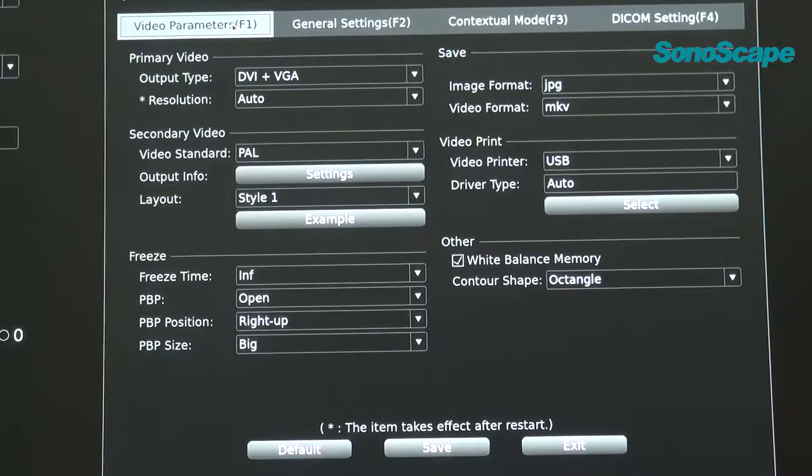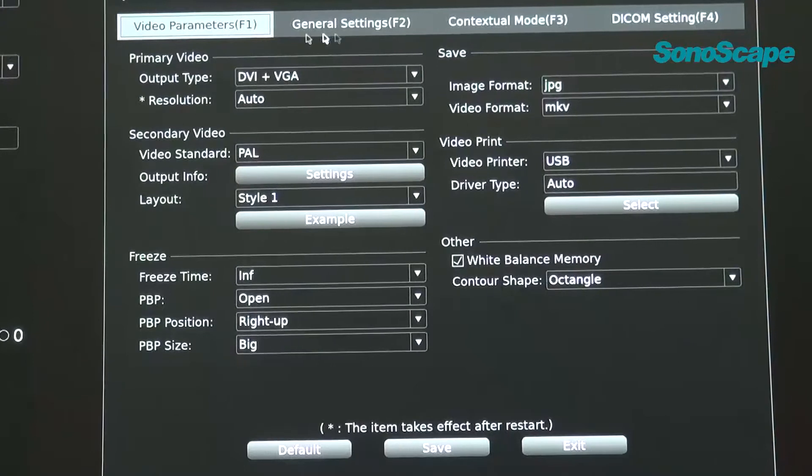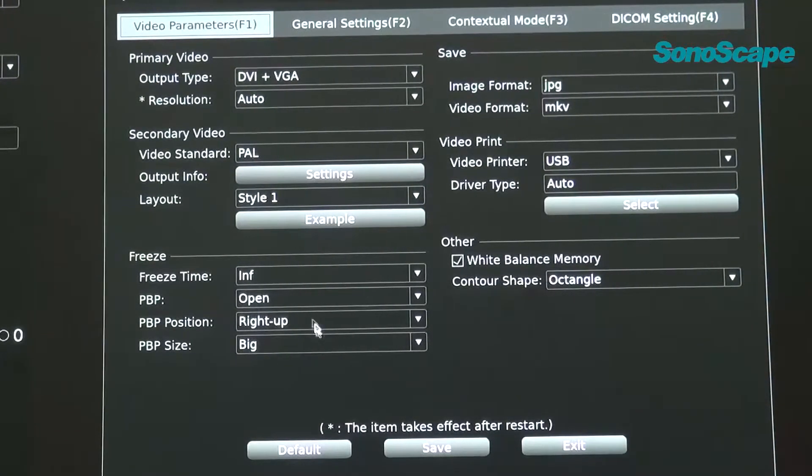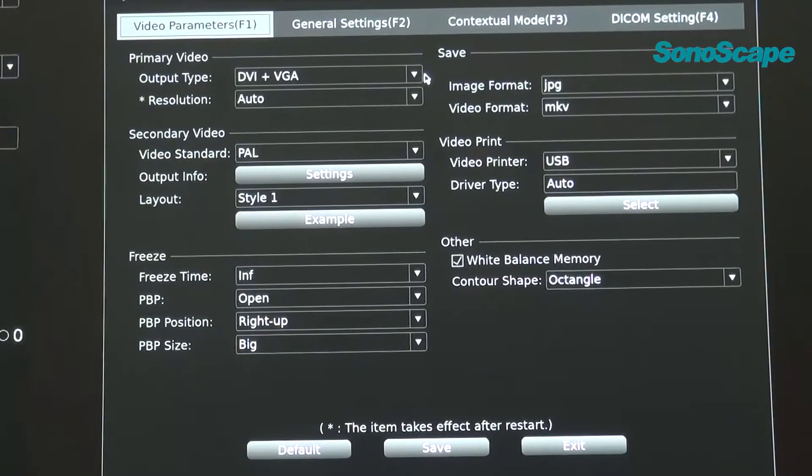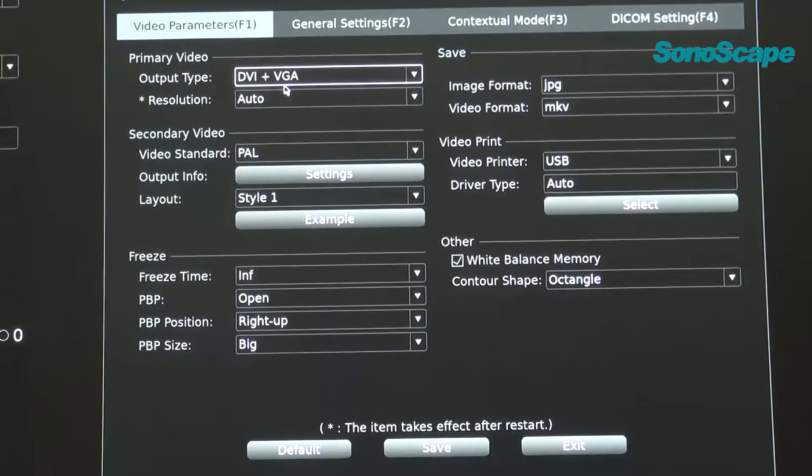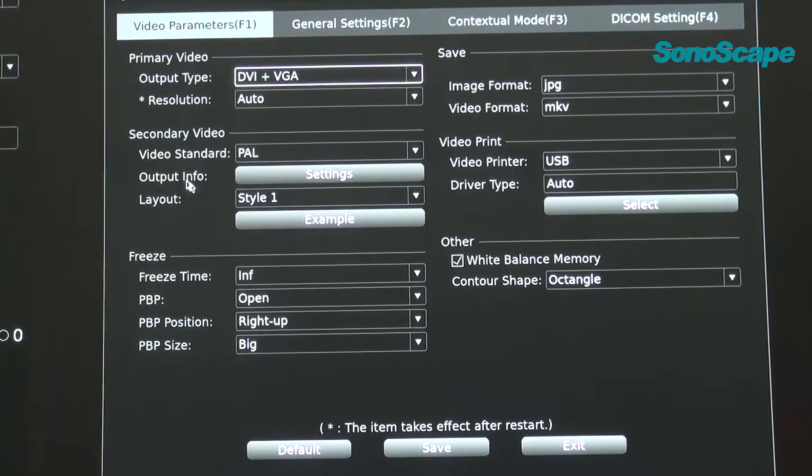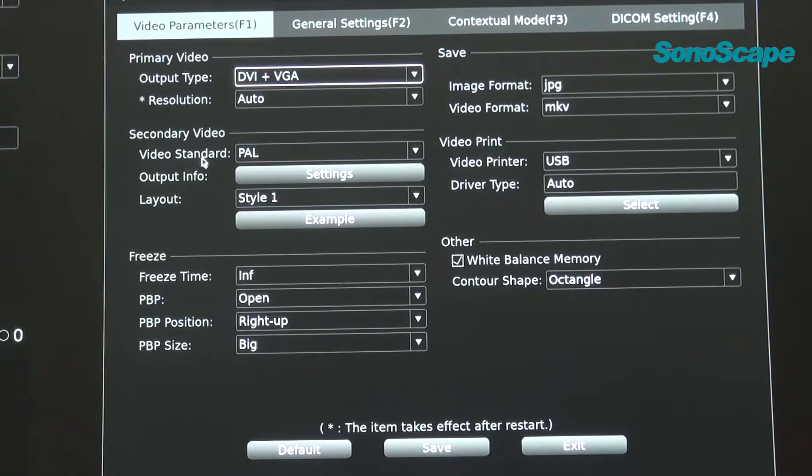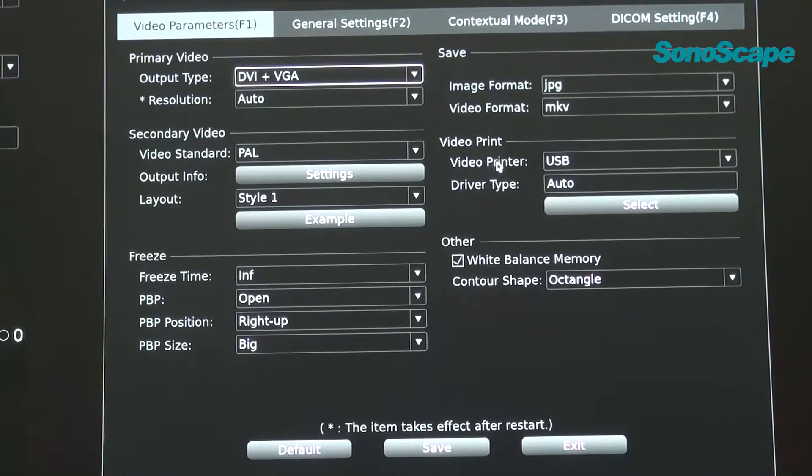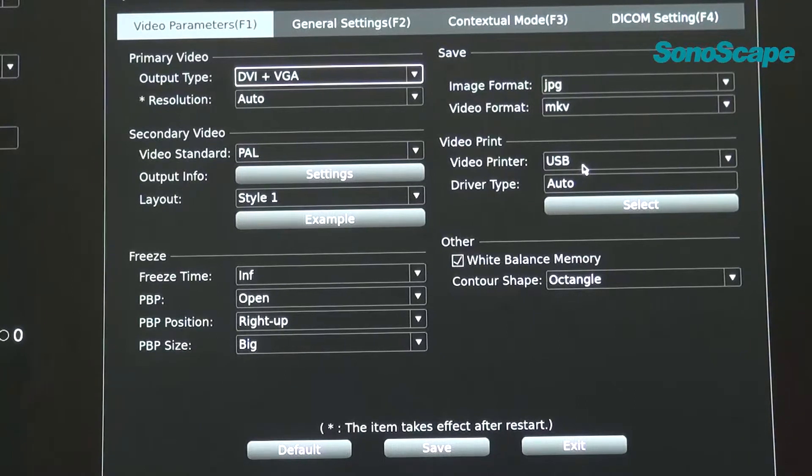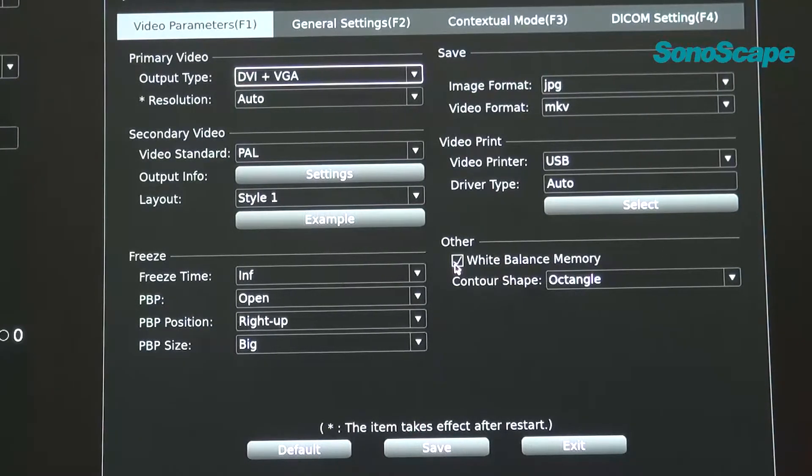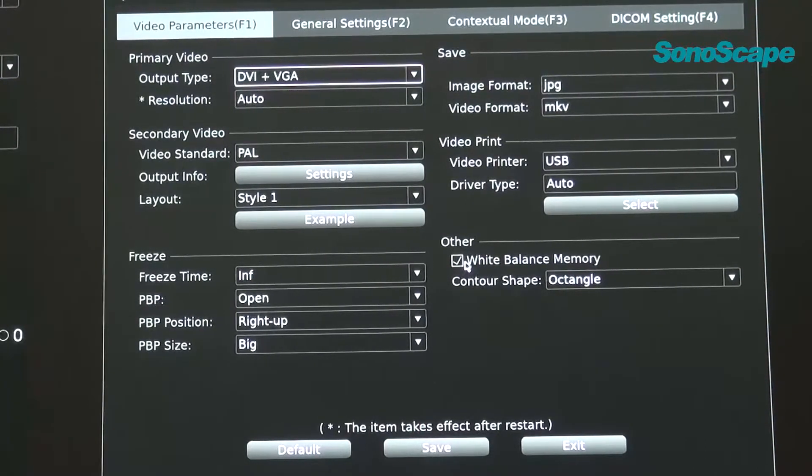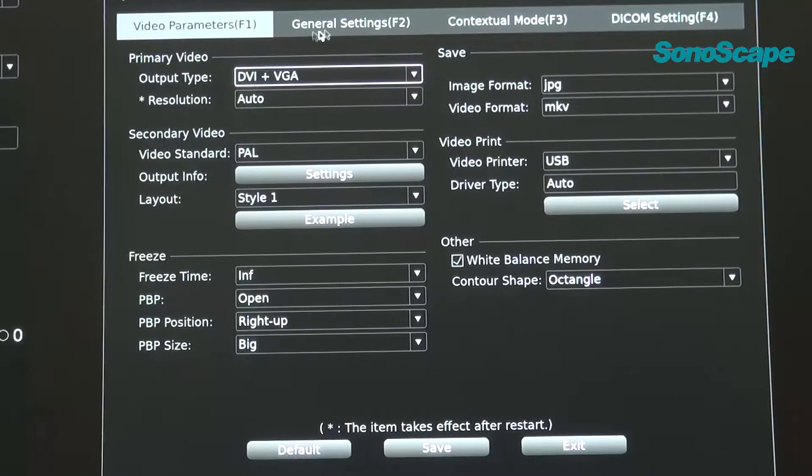You can select F1 to F4 to switch between those different pages. For video parameters, in this page, you can select the primary video output type. And usually, we will make it DVI plus VGA. And also, we will pay attention on video standards. The default setting is PAL. And also, for video print, we make the default is USB printer. Freeze time settings you can available here. And to remember that, we will select the white balance memory to make the white balance automatically saved in our processor.